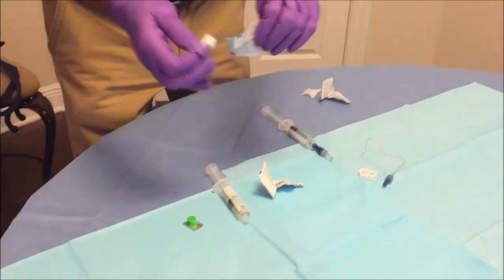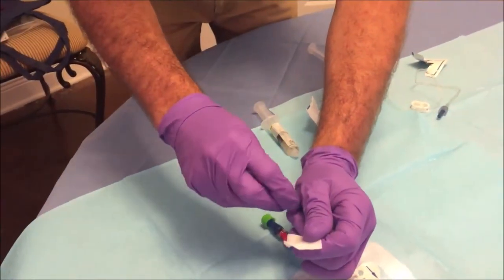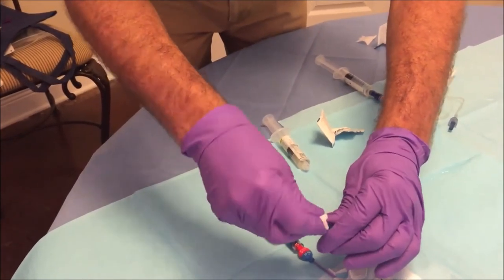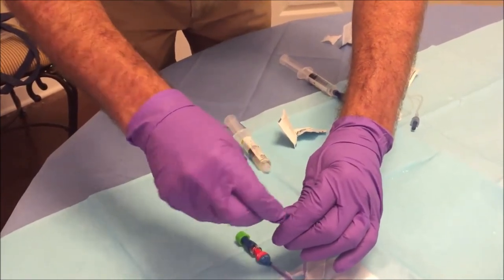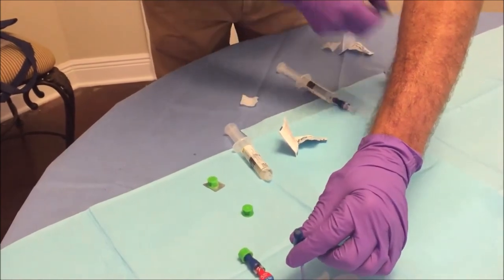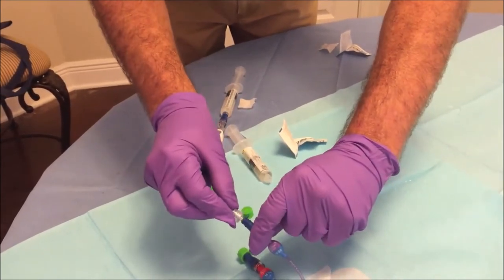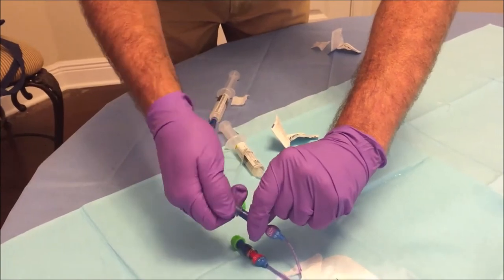At this point, get another alcohol swab. Remove your green cap and clean the tip of the clave for roughly 20 seconds. Allow it to air dry for 10 seconds. Then remove the blue cap and connect the extension set to the clave by pressing and turning at the same time.